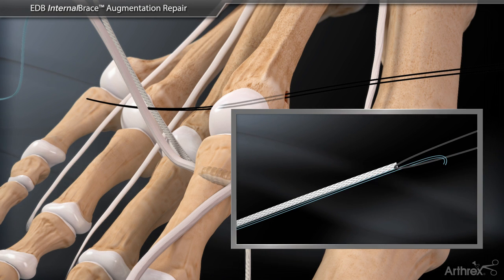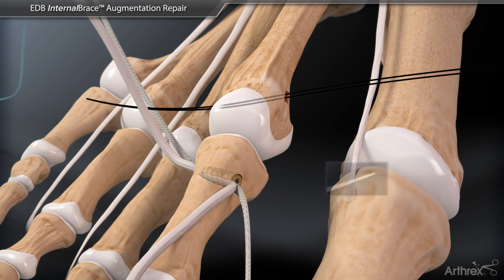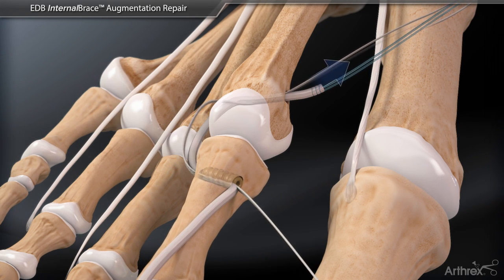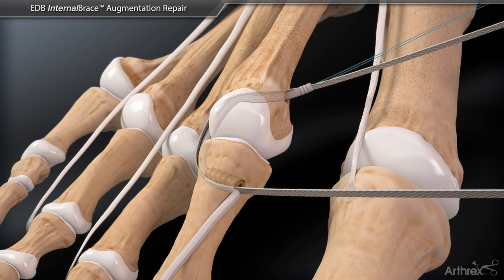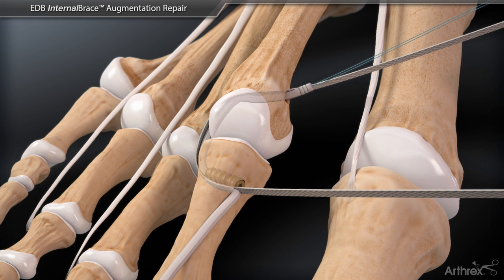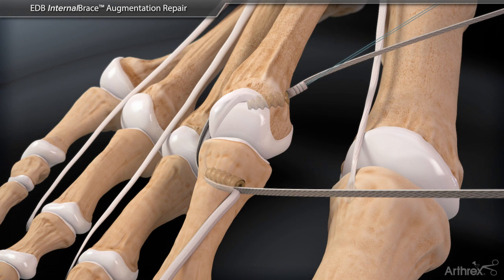Next, using the nitinol suture passing wire, shuttle the whip stitched tendon and labral tape suture from lateral to medial through the metatarsal head. Pull tension medially on the construct until the desired correction is achieved and the toe is brought back into an anatomic position. Finally, insert a second 3 by 8 mm peak tenodesis screw into the metatarsal tunnel to set the final tension of the construct.